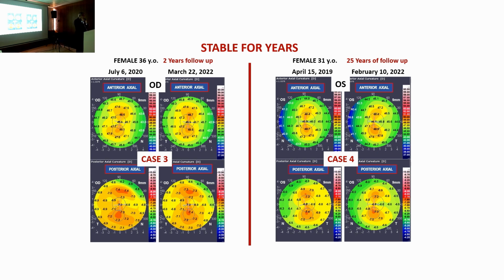And in that eye, because of the anisometropia, she had almost 6 of cylinder in that eye. I put 2 segments, 90 degrees arc, and now actually the astigmatism was inverted, okay, a little bit, but now she can use both eyes together.